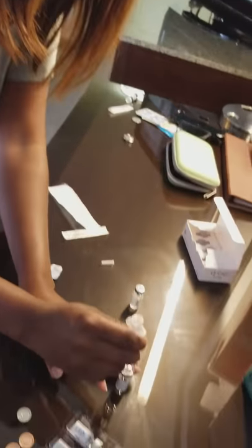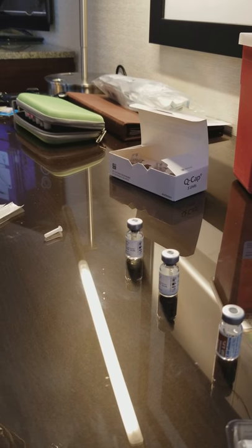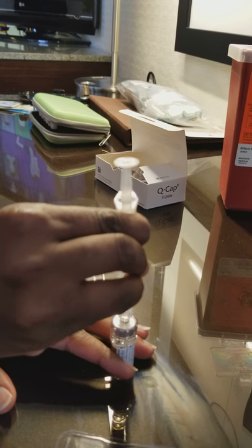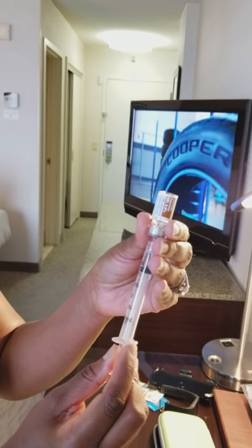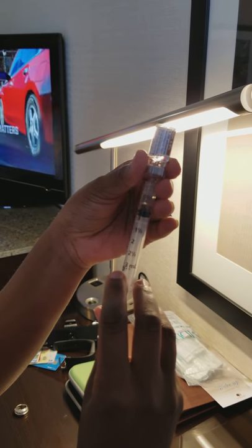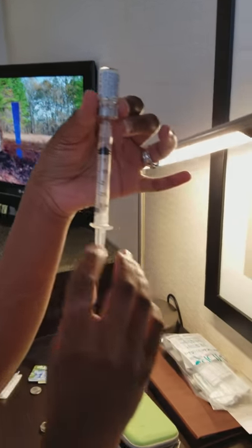Now we have the Menopur. We need to go to the water — we need to pull back half a cc. Push this in here, push it down. Turn the whole thing up, and we're going to pull back a half a cc so it can go inside. You're only supposed to have a half — half a cc. Push it back in there, turn it back up.